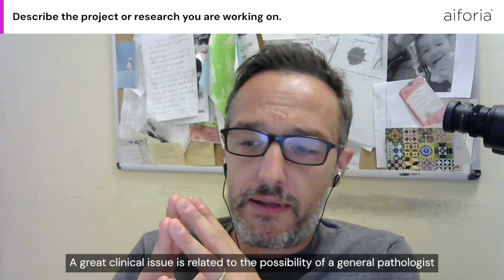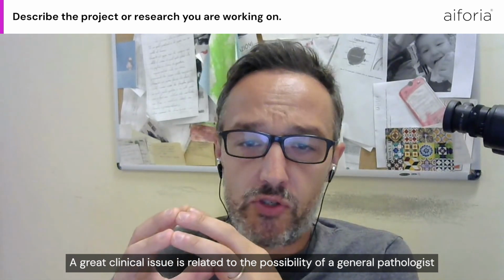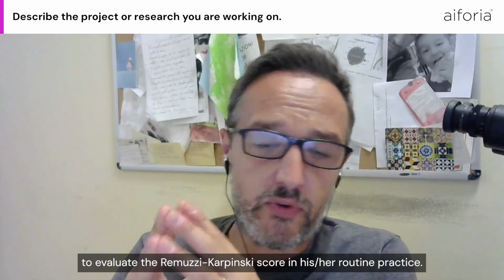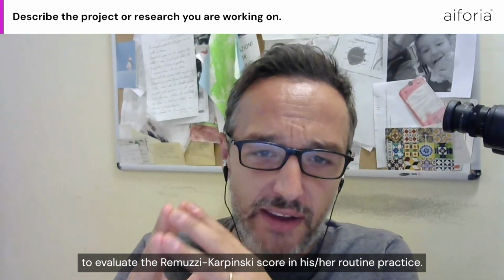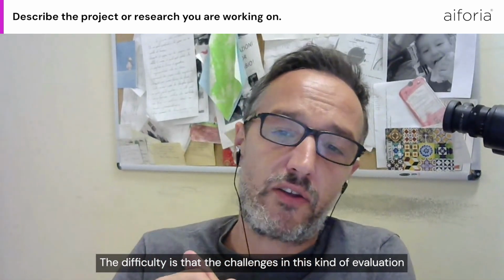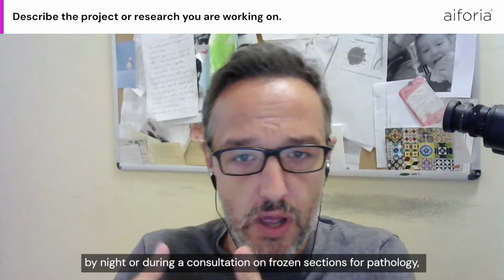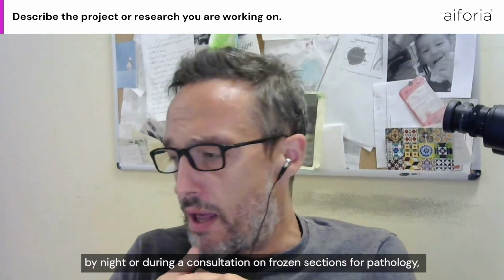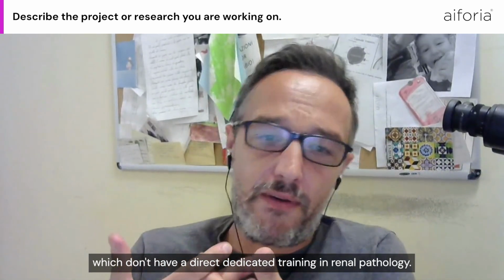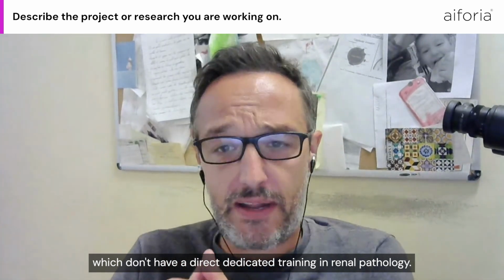A great clinical issue is related to the possibility of a general pathologist evaluating the Remuzzi-Karpinski score in his or her routine practice, and the difficulties and challenges in this kind of evaluation by night or during a consultation on frozen sections for pathologists who don't have a direct, dedicated training in renal pathology.